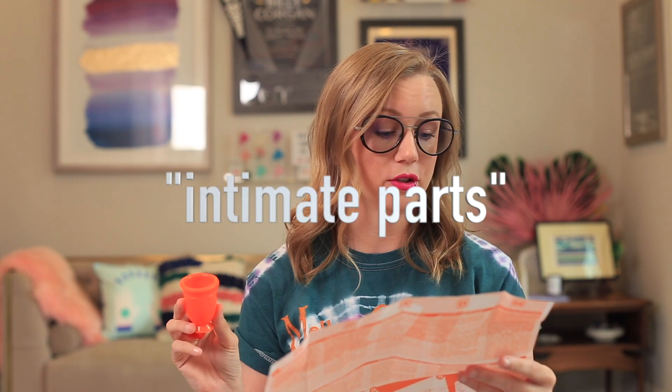So this cup and this golf tee thing — which a friend of mine now refers to as a 'vag tee,' and I'm stealing it, it is a vag tee — is only for the extraction. I feel like that's the best word to use for a device like this instead of removal: it is for the extraction of the cup. They say it is the only menstrual cup in the world with an extractor that makes it simple and easy to remove without the fingers coming into contact with the intimate part.